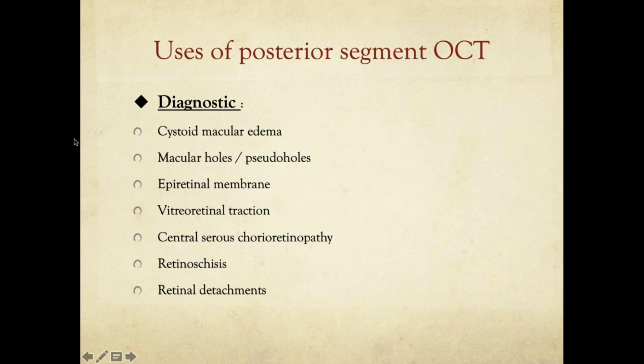And as I was just saying, with a patient who has diabetes and wants cataract surgery, what I see in most of the people who are practicing is they just do an OCT to see if there is a macular edema. The central macular thickness is completely fine, so they send for cataract surgery. Then you have a macular edema with cystoid edemas.